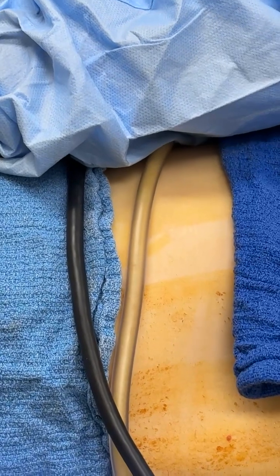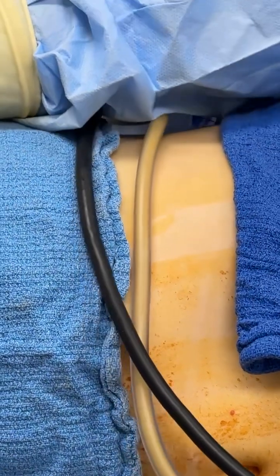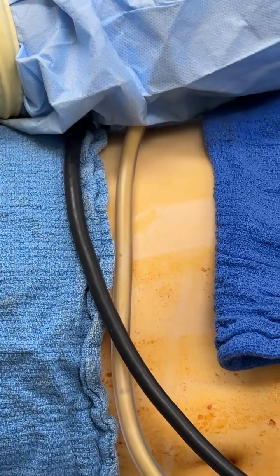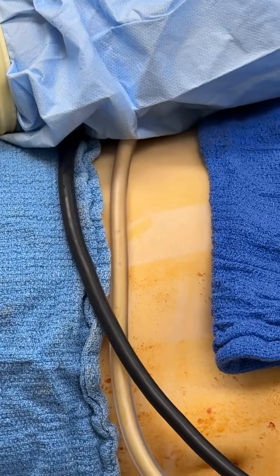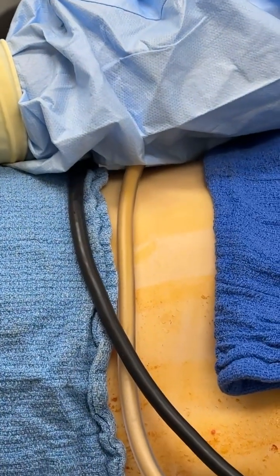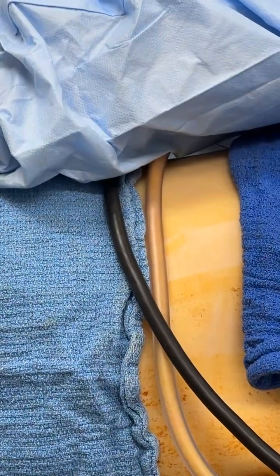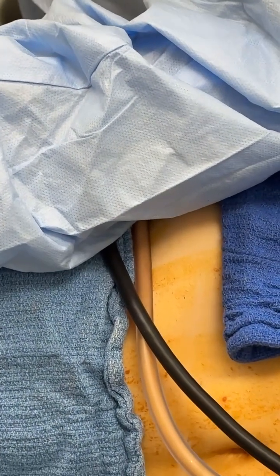All right, so we're toward the end of the procedure, and look at that beautiful yellow fat. We're almost done, and there are many benefits for the surgeon as well. Less risk of repetitive motion injury, like for example tendinitis, like tennis elbow, or shoulder pain, or even wrist pain, because my movements are very calculated, right? And so this is the best way to do it.